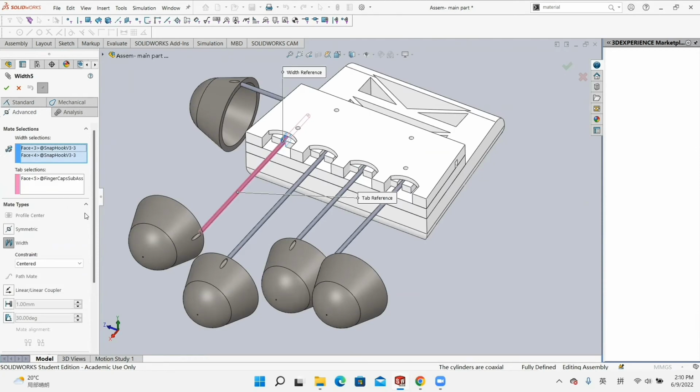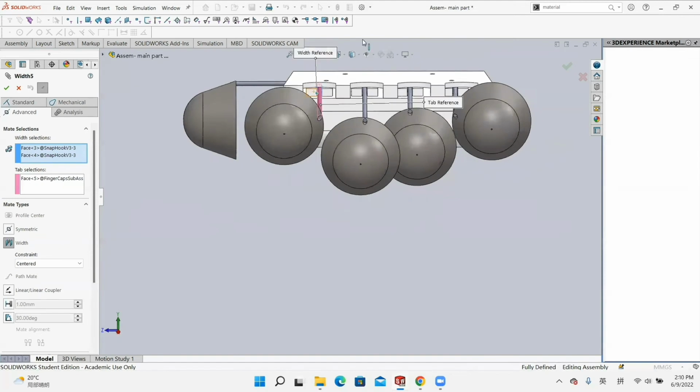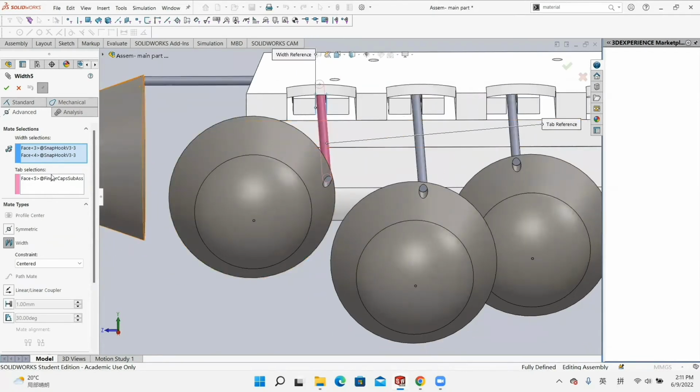The last step is placing the elastic cord to their corresponding positions. By doing that, we use 2 width mates, because the gaps between these hooks are slightly larger than the diameter of the elastic cord. Also for the gaps vertically. So we choose the opposite faces of 2 hooks in one group and tab selection the elastic cord, to make the elastic cord placed between the gaps of the hooks.